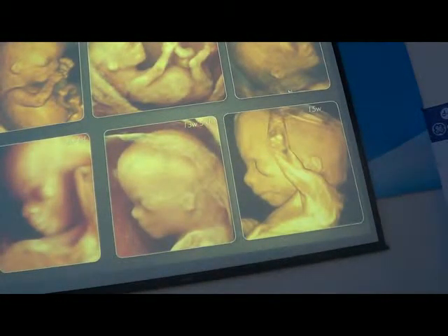And here are different aspects of the fetus during the first trimester of the pregnancy, from 11 weeks to 15 weeks. Here is the fetus from 11 weeks 5 days up to 15 weeks. You can see it develops clearly, with a normal position of the ears in a low position at this stage.